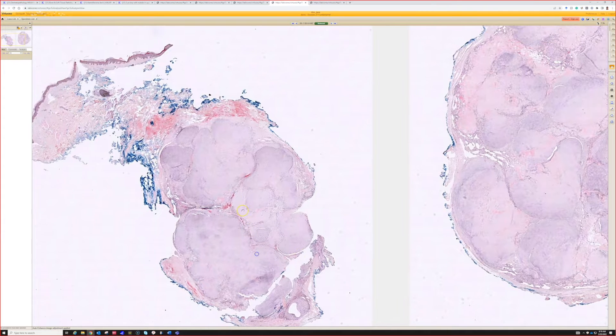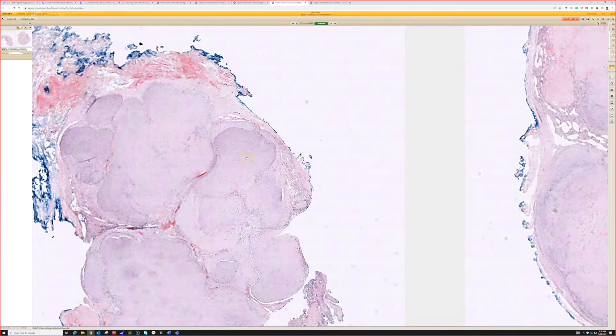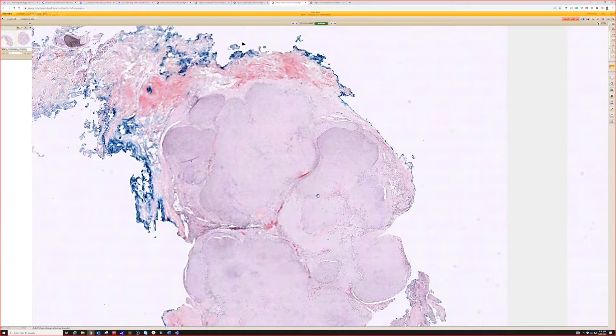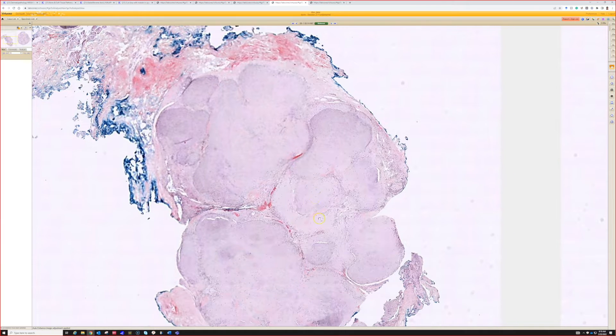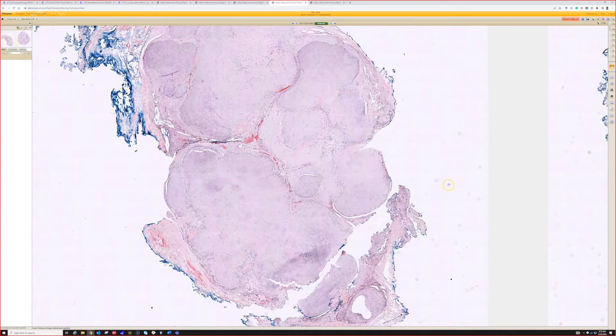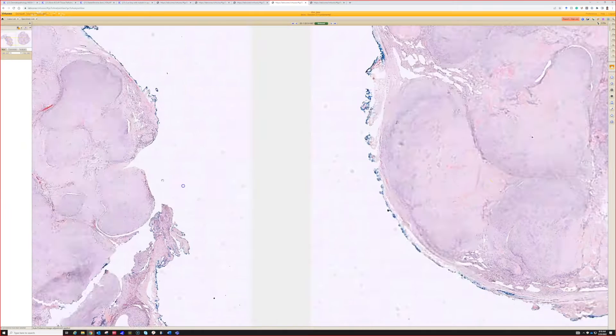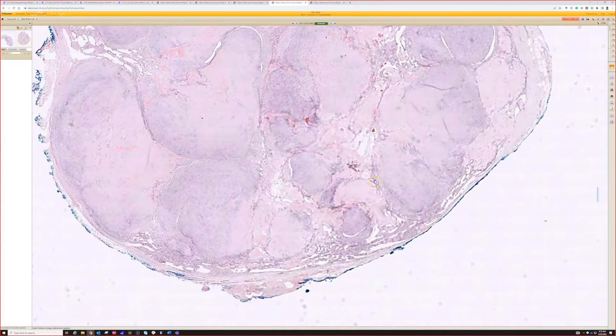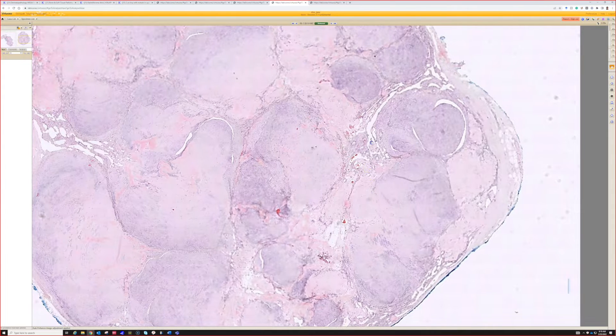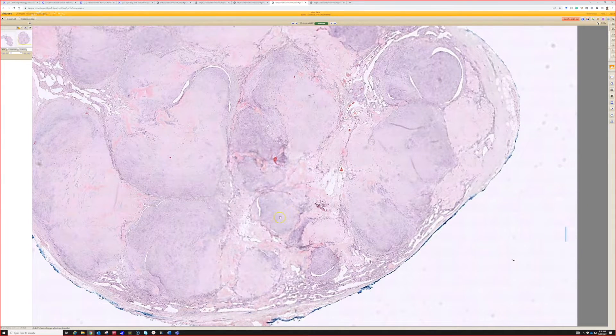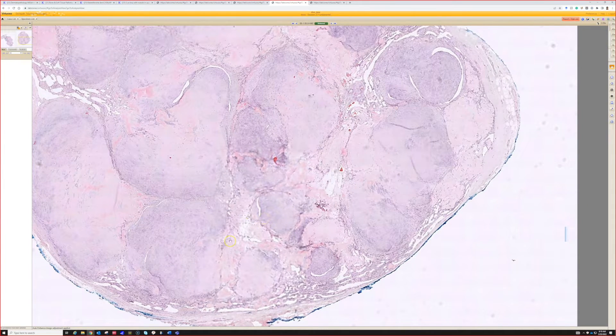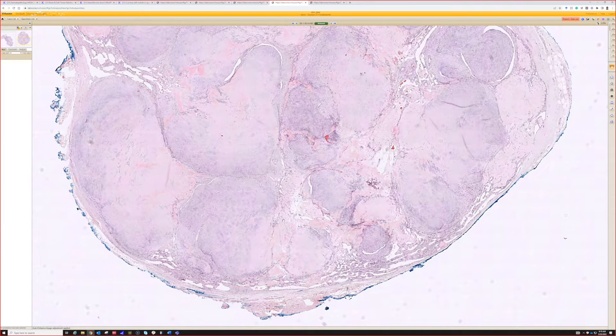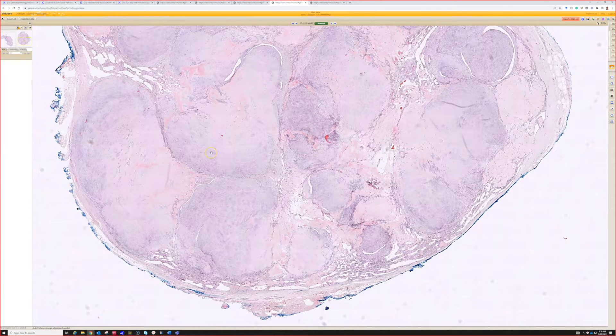It's pretty, kind of biphasic with these two different colored cell populations, almost oriented as nodules within the specimen.